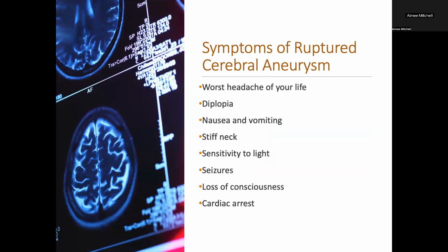Is TCD more effective than CT, or is it just using a combination? It allows for real-time monitoring. So that's what's good about it, so that they can see what the immediate effects are of the treatment, versus transporting patients. Yeah, and it's portable, so it's easier to use.